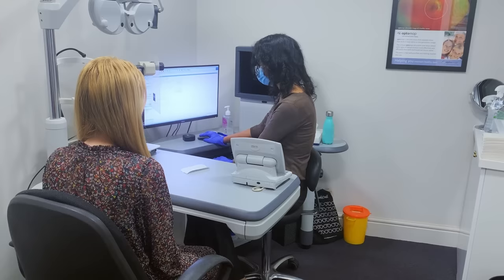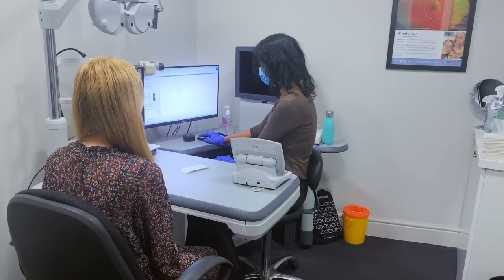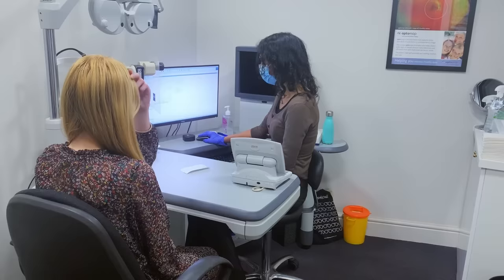And any allergies like hay fever? Hay fever, yes. Has it kicked in yet? It's actually not too bad so far this year. Good. Okay, and anybody in the family with glaucoma or any other eye diseases that you know of? Not that I know of. Okay, great. And any diabetes in the family that you know of? Yes, my grandma and my aunt.